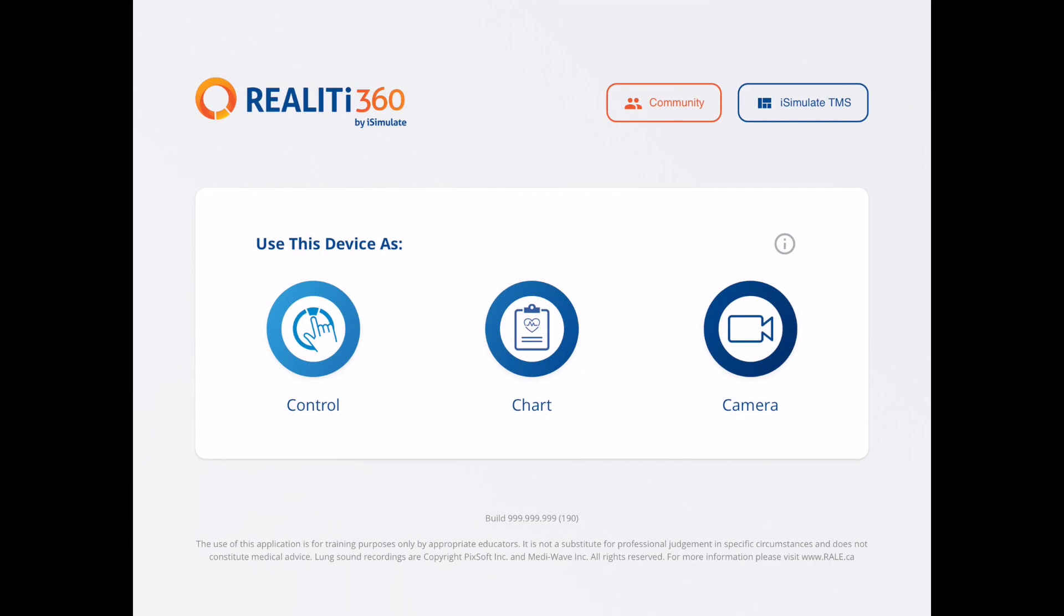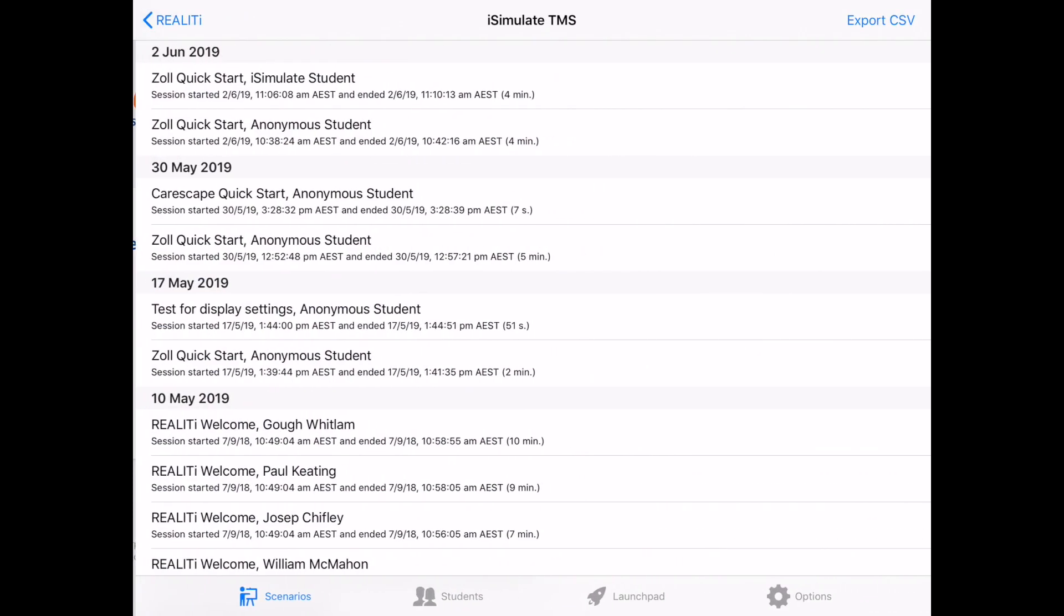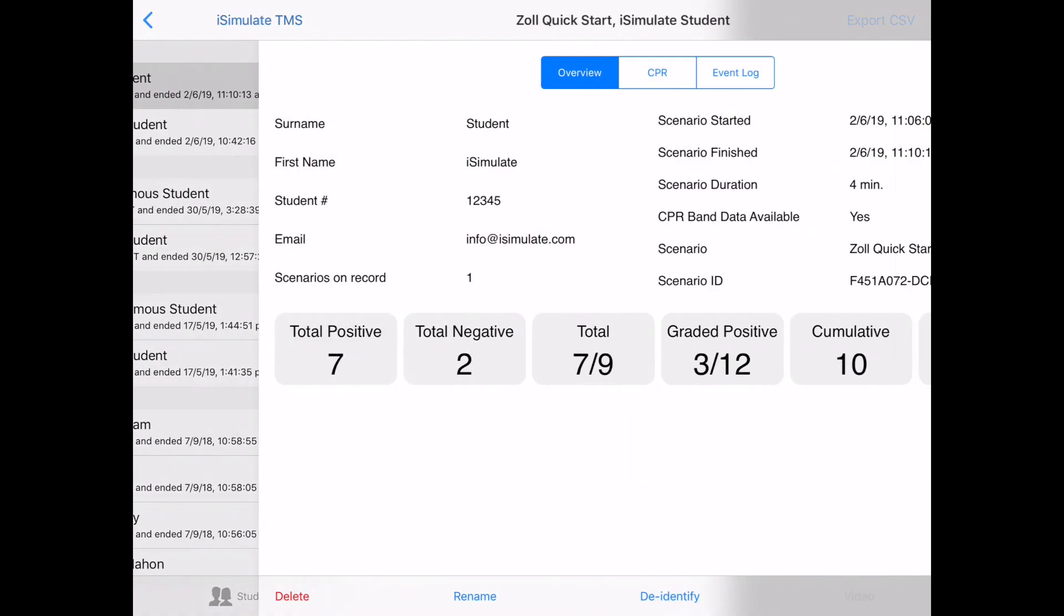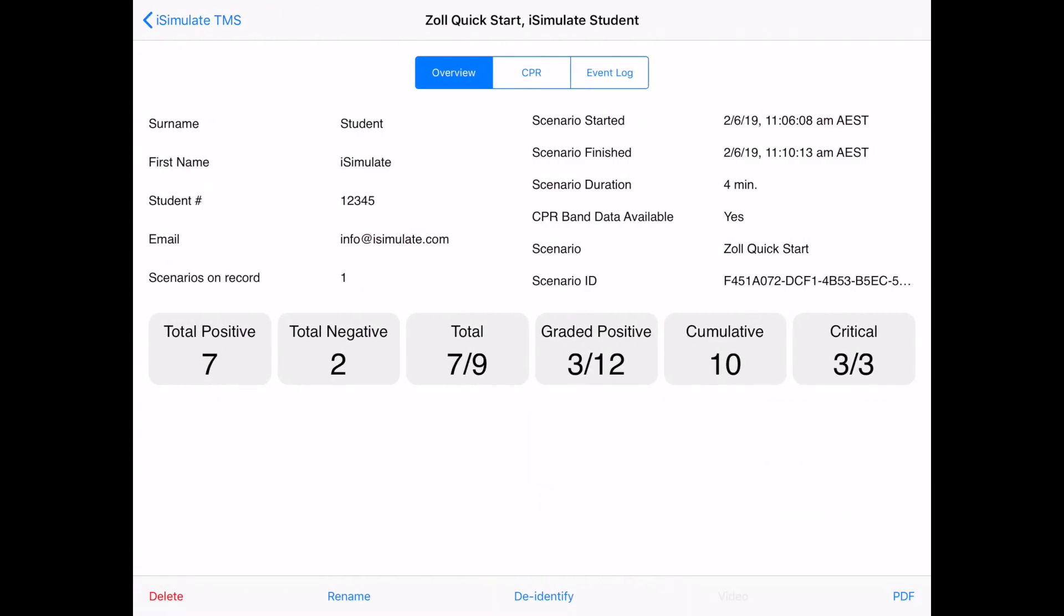This is the button in the top right hand corner. Now you can see the scenario that I've just run. It's in the top here. And what I'm immediately presented with is an overview.